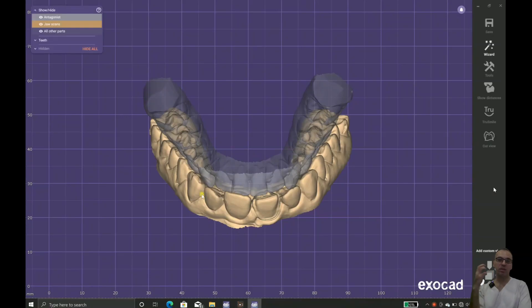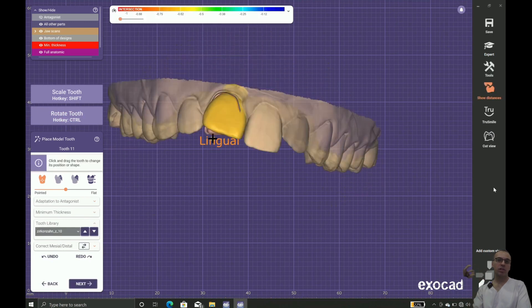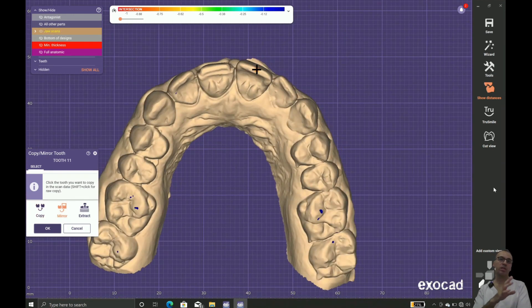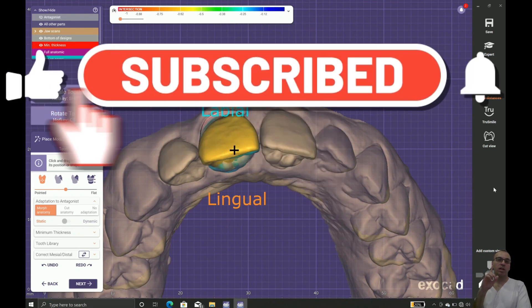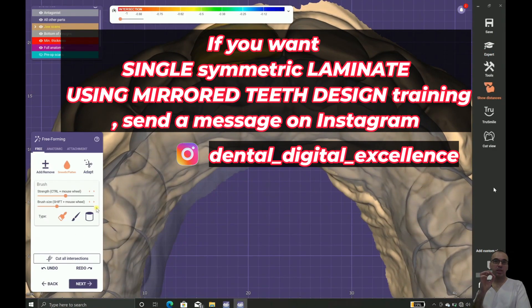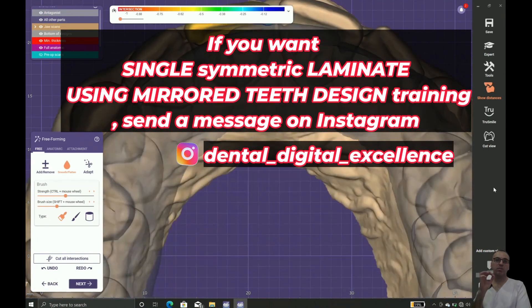Mimicking the same textures as tooth number 21. I may change the library, extracting and copying from the same side, matching the tooth size and position — with no gap. Based on the pre-op I did before, it's a perfect copy of the other central incisor.